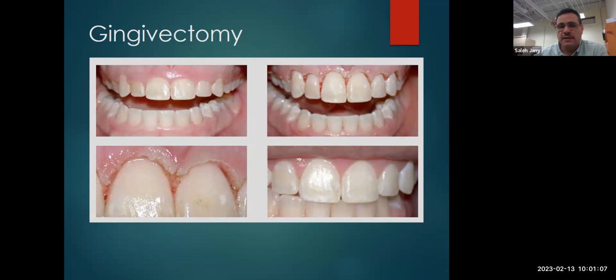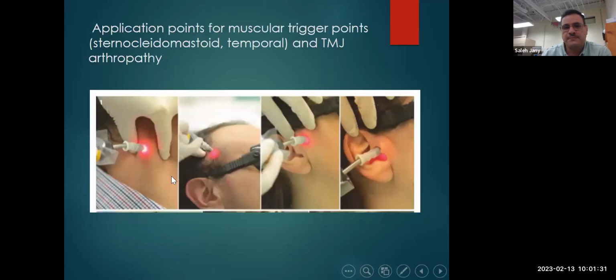I know the laser will cost thousands of dollars, but a cutting blade will cost like $5, and you cut the tissue. It's a big difference. But the thing with the laser is there's no bleeding. We have just a few drops of bleeding, and the tissue will be sterilized. The bacteria will be killed by the heat of the laser, and the damage will be uniform.